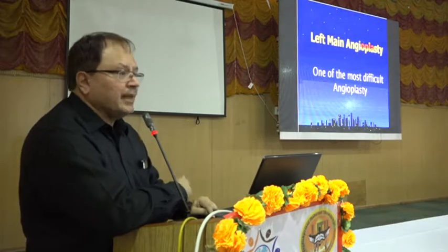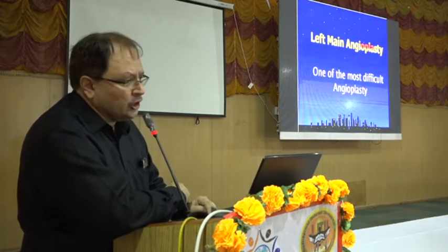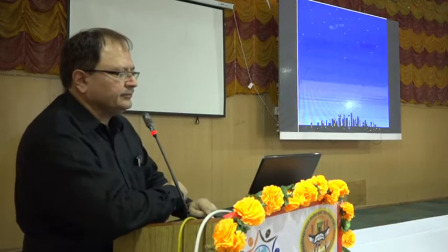What about left main angioplasty? Again, left main angioplasty is very, very difficult to do, and all left main angioplasty should be done under cover of IVUS. Make a note of it: under cover of IVUS. So I'll tell you an example.